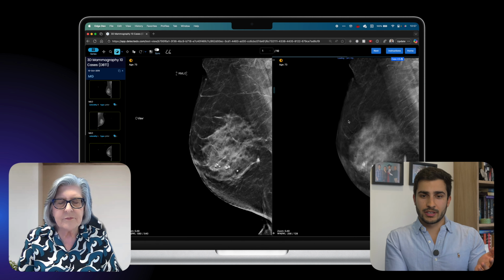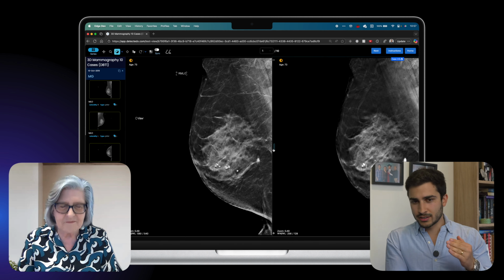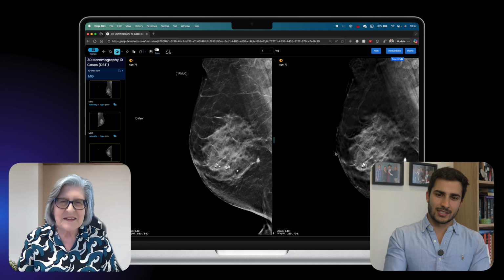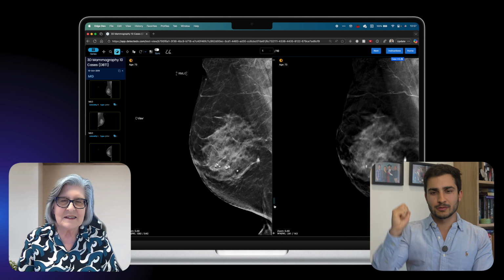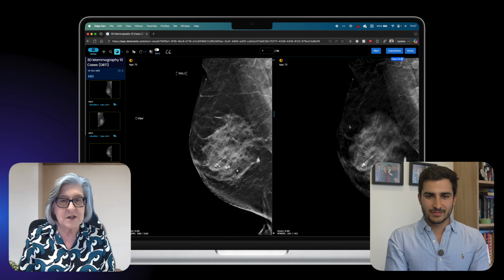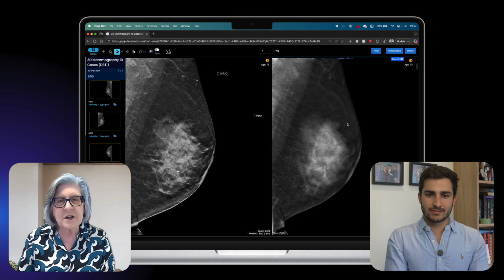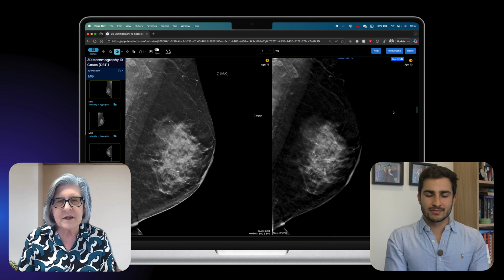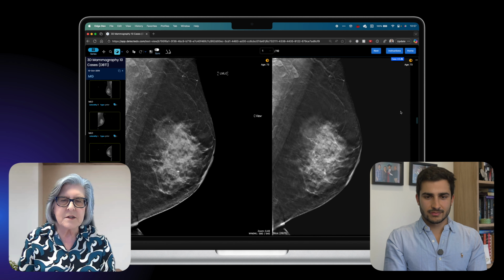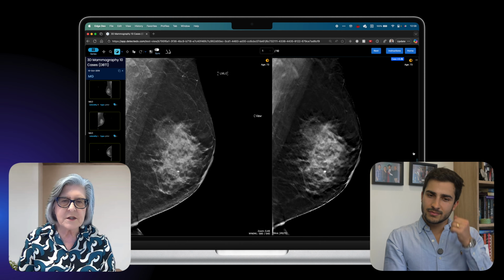Particularly when you're looking at 3D images. I know trying to display a CT to a class is a nightmare unless you have the system where you can easily scroll through the images, which makes it a lot easier. Yeah, that's correct. I mean, obviously, there's a lot of 3D imaging in breastwork, digital breast tomosynthesis, and you have the ability there to scroll through and stop to check various levels that might interest you. So yes, it's a great way of interacting with images.